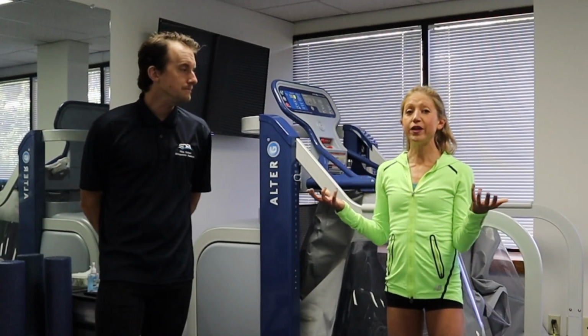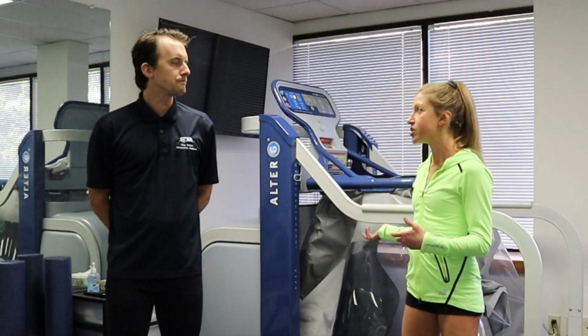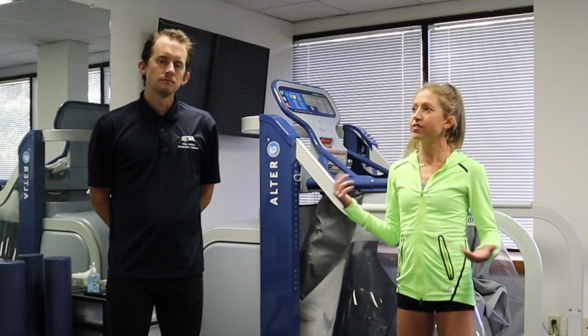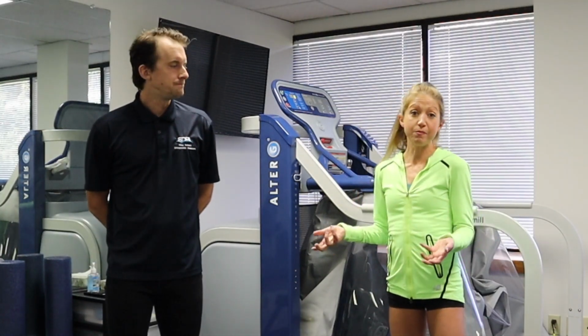outside. And I mean, how many of you want to run, but gosh, it just hurts your ankles, your knees, your joints, your hips, because the impact is so intense, it's so hard on the body. The AlterG enables you to run without as much impact. And so it feels like running on a cloud, which I think is actually why a lot of people spend more money on Hokas these days, because Hokas are fluffy and they give you less impact on the body.